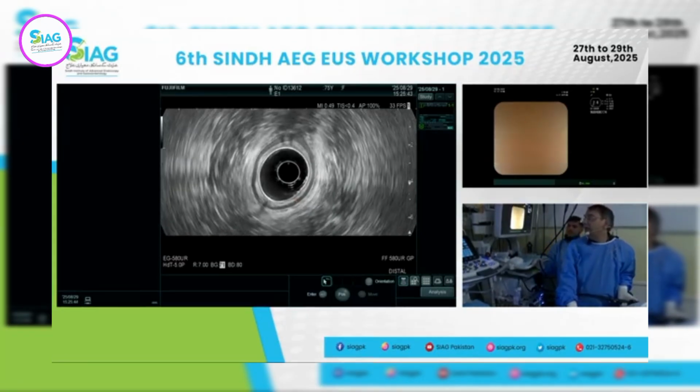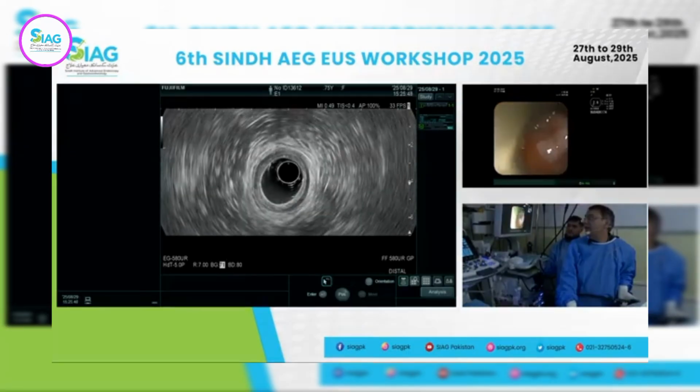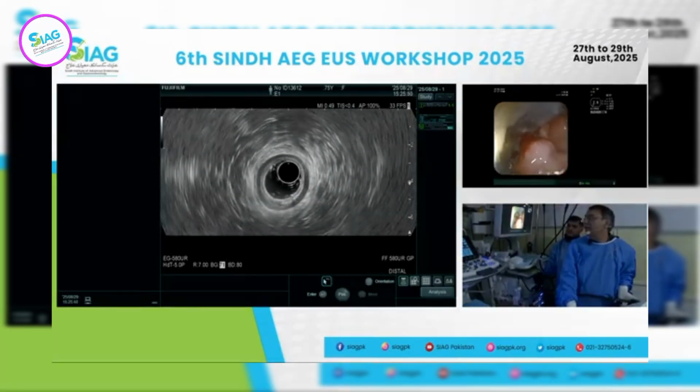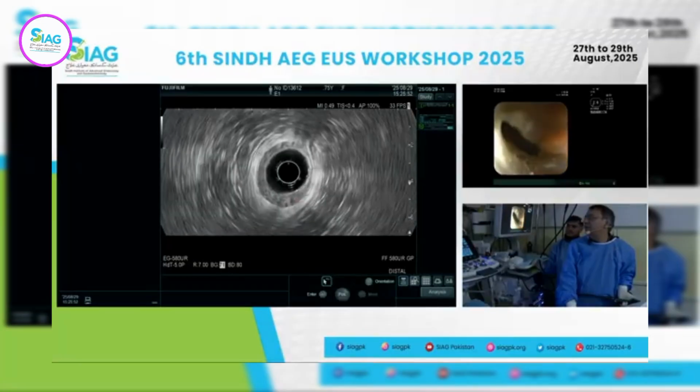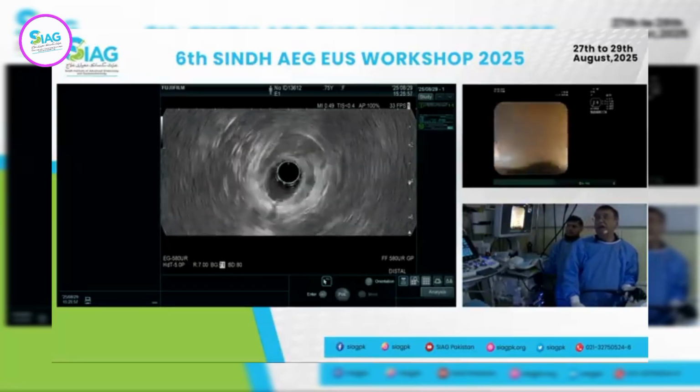So I'll come back a little bit, come back a little bit, and come back. We are almost getting out. You see that where it became a little bit fuzzy, there was a hyperechogenic area around that.